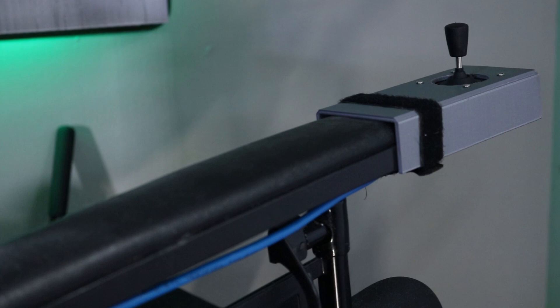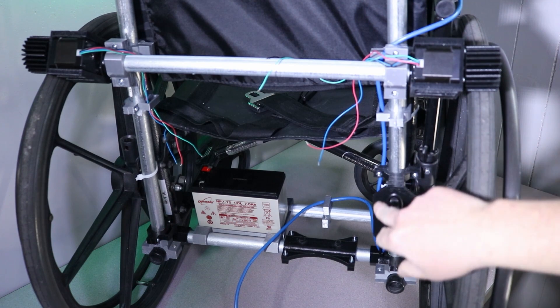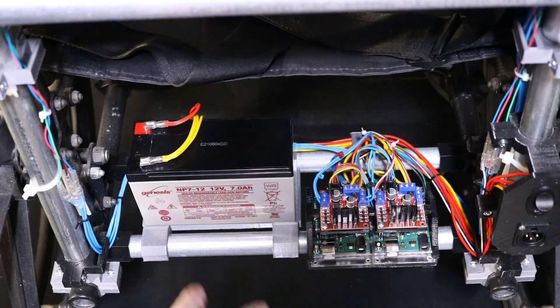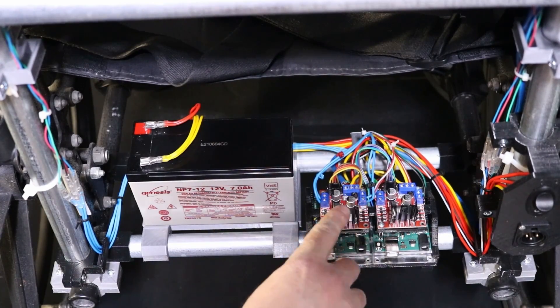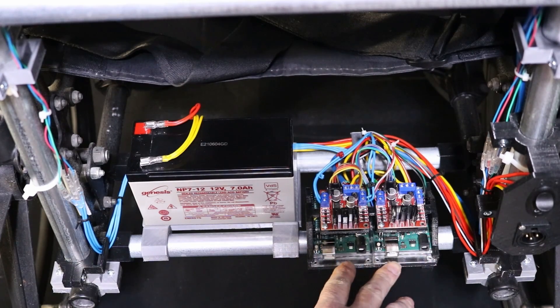We have our controller set up on the wheelchair. As you can see, the cable is coming through here, then coming down in behind the XLR and power, and down to the final turn. We have it all wired up — we've got the L298N ends set up. The only thing we need to do is get the code uploaded to the Arduino UNOs.